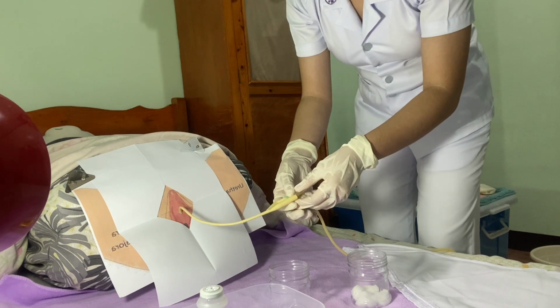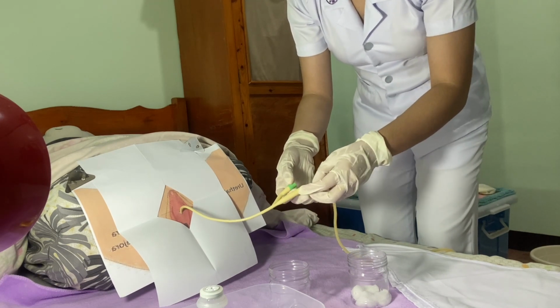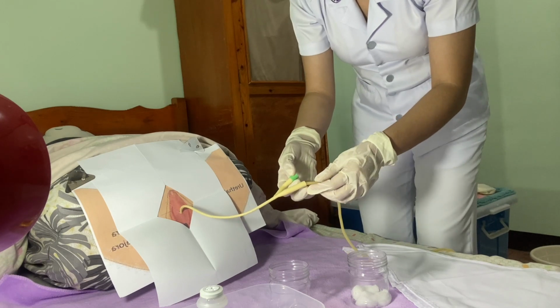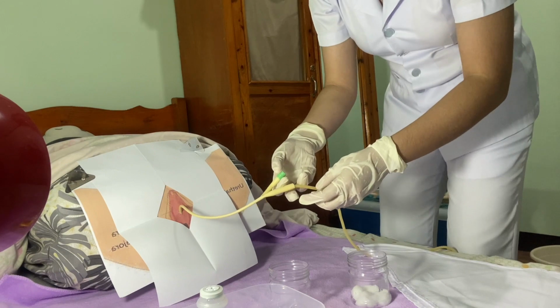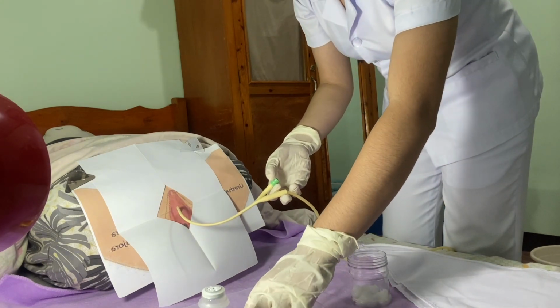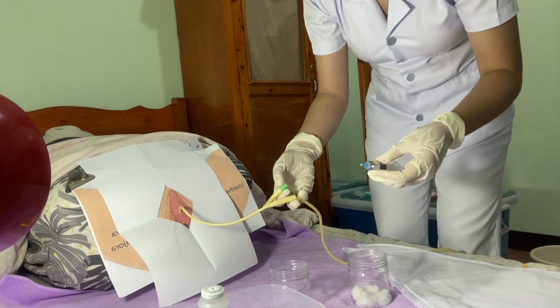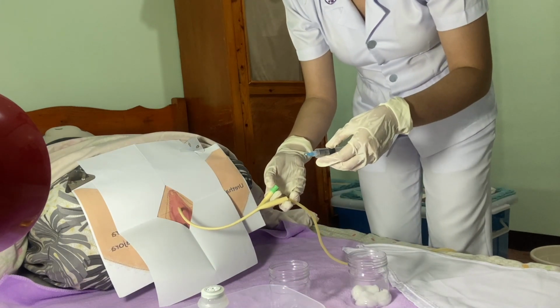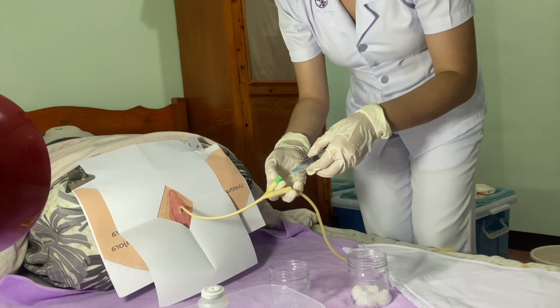Okay, so now we have to inflate the balloon with 10 to 15 cc of sterile water using a 15 to 20 cc syringe. So the balloon will prevent the catheter from slipping out of the patient's body. Also, if the catheter needs to be removed, then the balloon will be deflated.